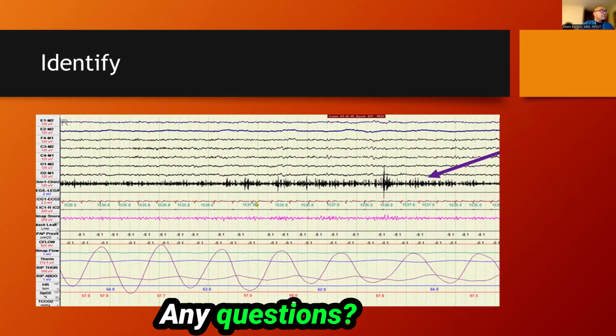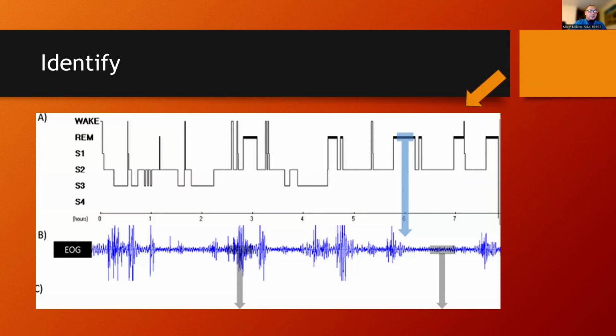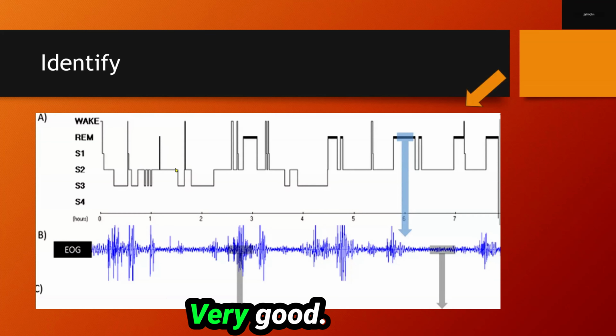Any questions? What are we looking at? Hypnogram. Very good.